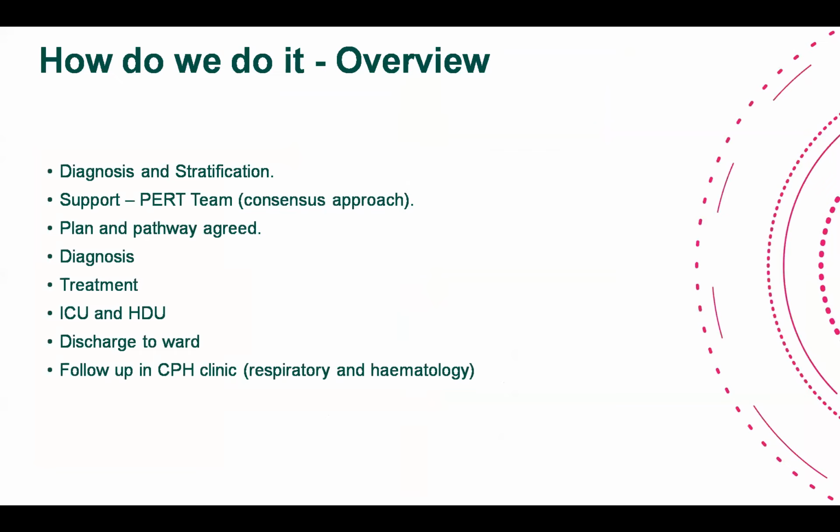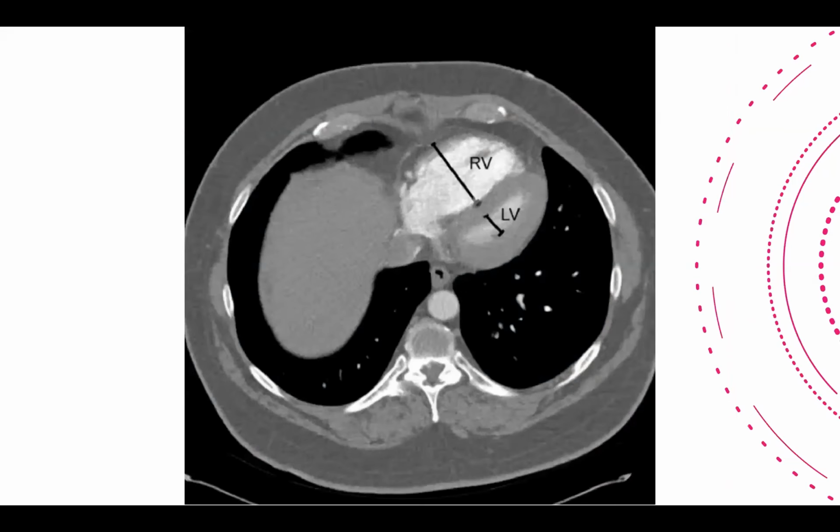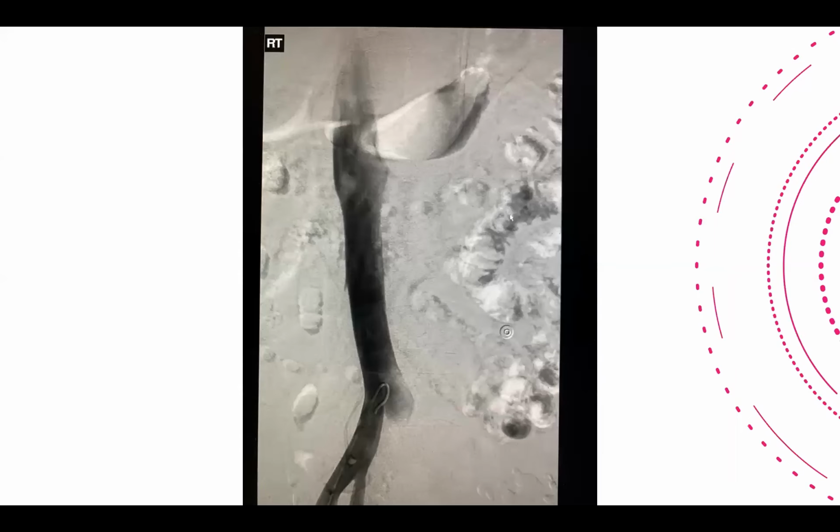So what we normally do, we diagnose the case when it comes to ED by CT scan, and then we call the PER team and plan that way. Establish the diagnosis, whether this is just a primary PE or maybe secondary. Secondary means due to underlying malignancy, and then the treatment plan, which way we have to go. And then we'll decide whether the patient will go to the ICU or HDU. And this is an example of submassive pulmonary embolism. You can see the clots there inside the contrast, inside the main right and left pulmonary artery. And this is the RV-LV ratio I mentioned before.